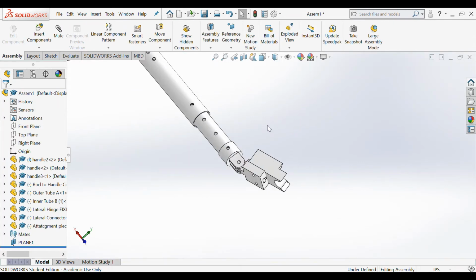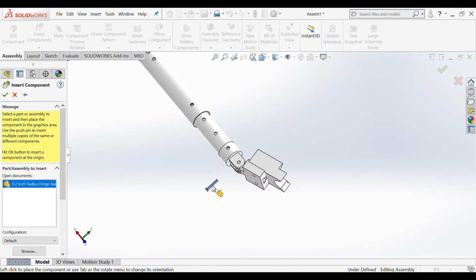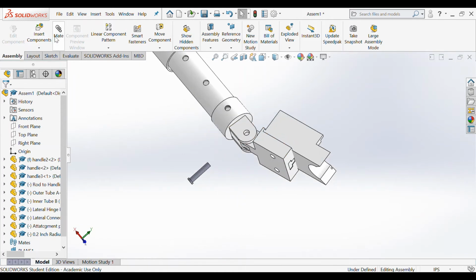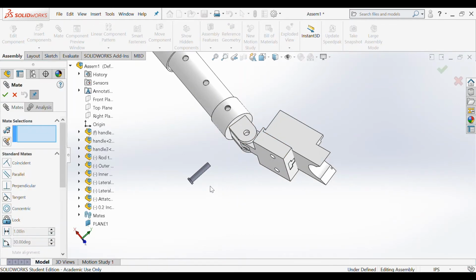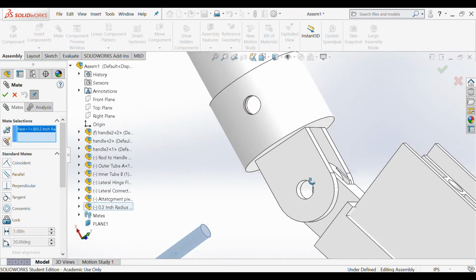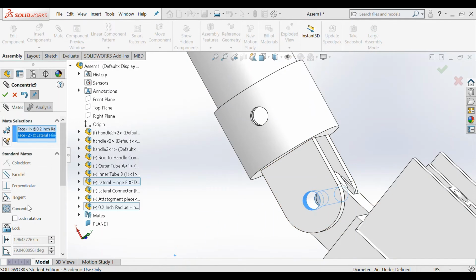Now I'm going to go on ahead and insert one of our fixed pieces. This is going to hold the lateral connector piece and the lateral hinge piece together. So we're going to click on Mate. I'm going to click on this outer surface right here and the inner surface of these holes. We're going to make them concentric.